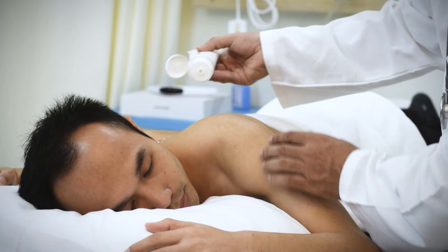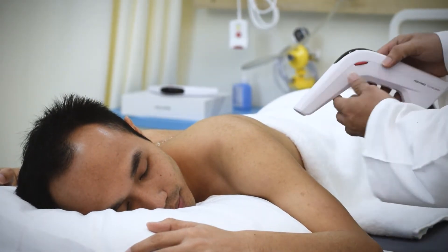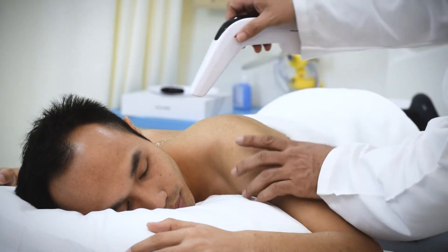Apply a small amount of Cura Laser Biostimulation Gel either on the therapeutic head or over the neck. Press the small switch to turn on the small therapeutic head.